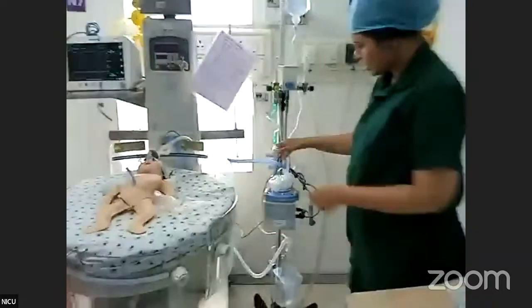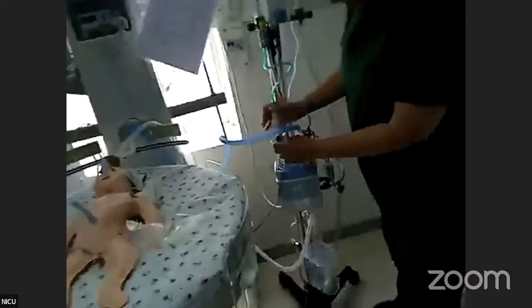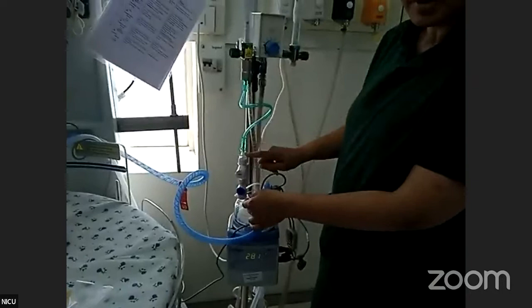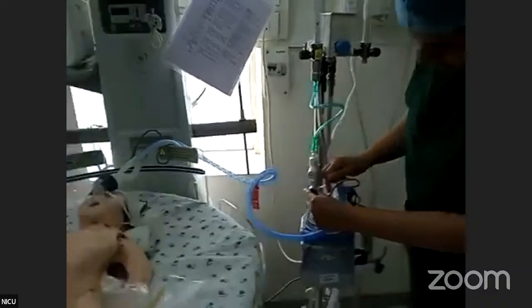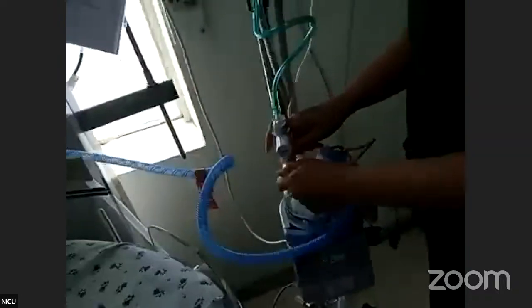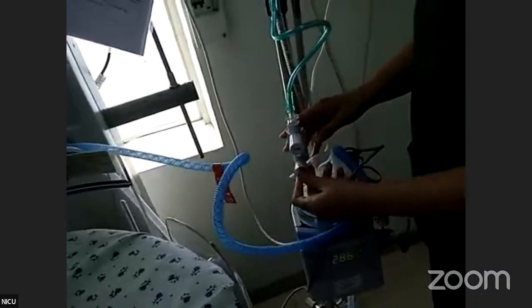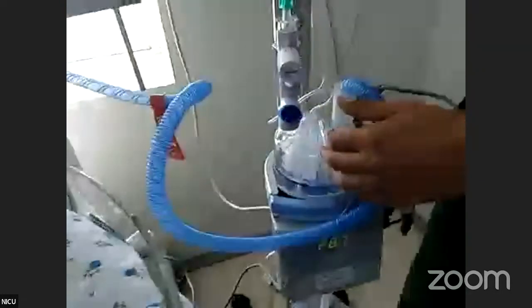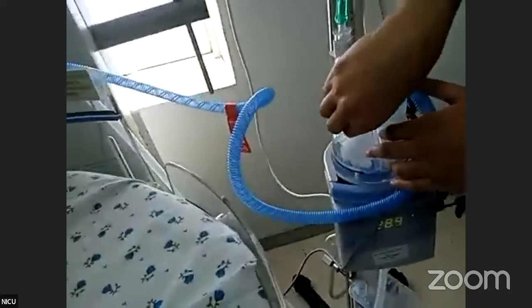Last but not the least, when it comes to the parts of the CPAP circuit, there are three important safety aspects here. There are 1, 2, 3 knobs between the inspiratory limb and the heated humidifying chamber. These are in this order. This represents the knob for measuring the FiO2. If you open, there is a cap here. On this cap, you can place an FiO2 meter and measure the FiO2 that is being delivered. So if we are sitting at 30% FiO2, we have an FiO2 meter or oxygen sensor that is commercially available. If you place the oxygen sensor, it must also be delivering 30%.